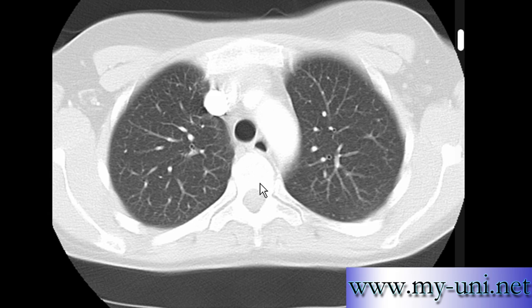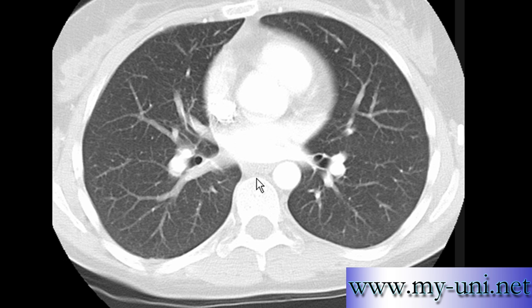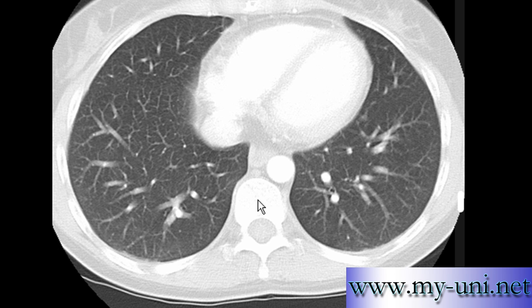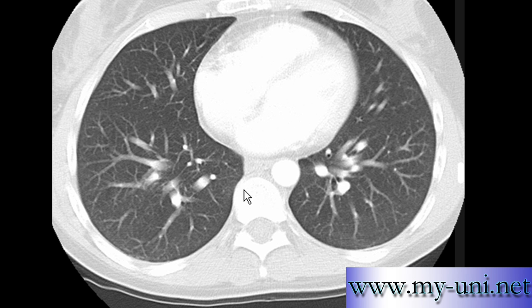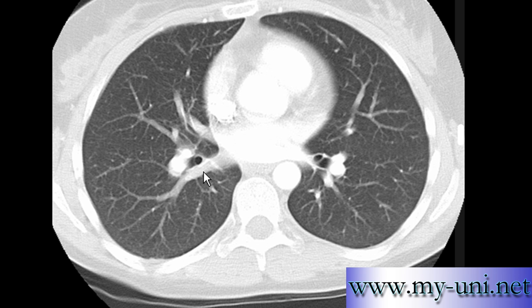First, a normal CT scan of chest in lung window. I want you to pay attention to the lungs. I am scrolling through the images so you can see a normal pattern — that's how normal lungs should look on a CT scan. Notice the air density within lungs, and the blood vessels passing through the lung parenchyma. They are bigger towards the hilum and taper and branch off as we move towards the periphery.